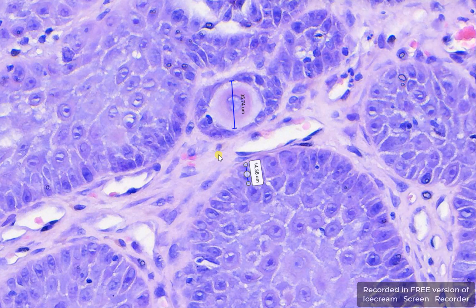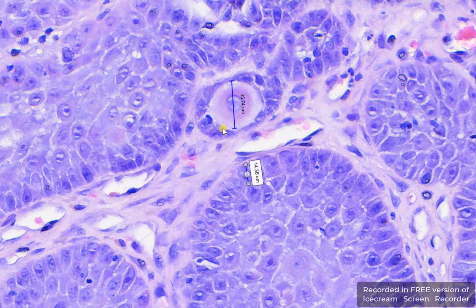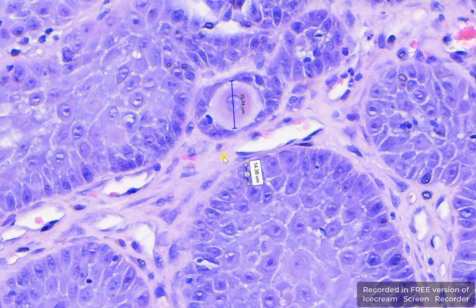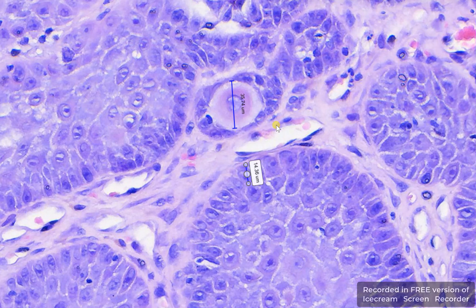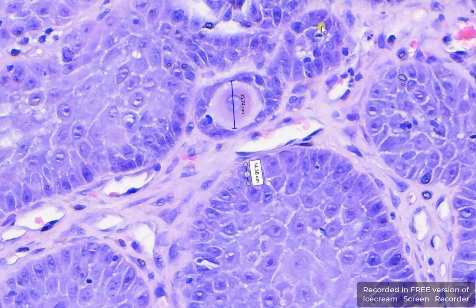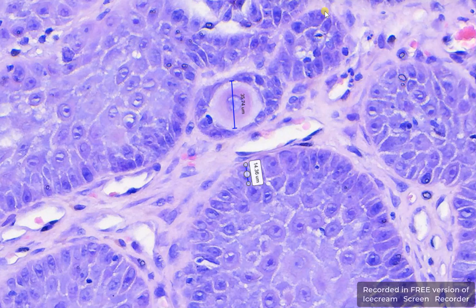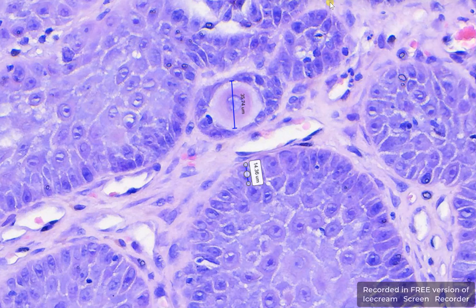This is what we call severe anisocytosis — when the cytoplasm has variability in diameter. So this was a squamous cell carcinoma and its characteristics in a female poodle dog.